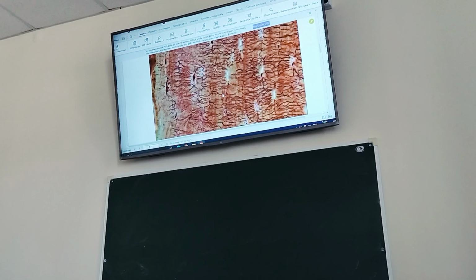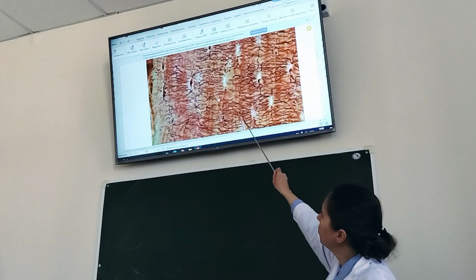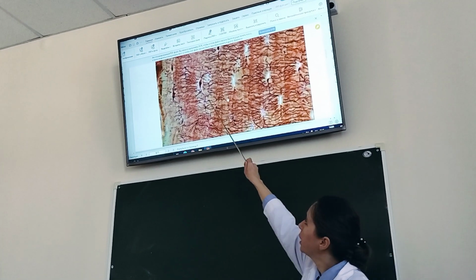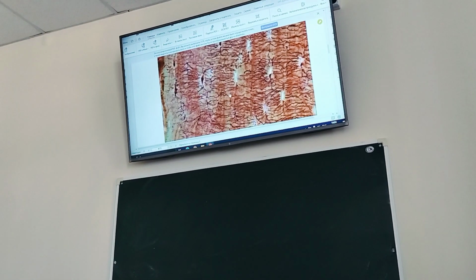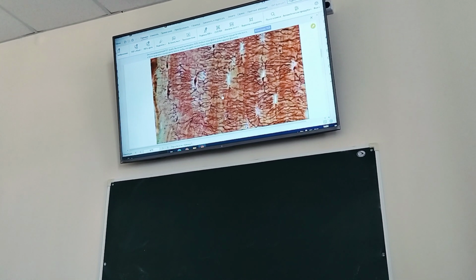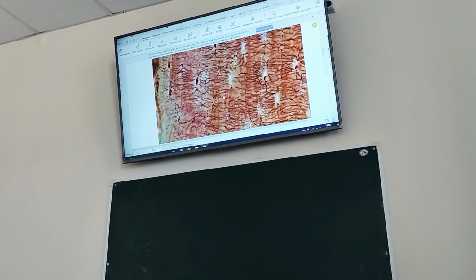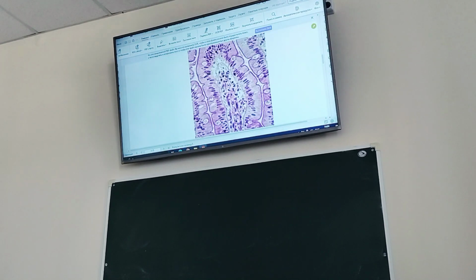What is this? Once again, what can I see? Many canaliculi and lacunae. Yes, bone, where osteocytes may be present. This is secondary lamellar bone, but in high magnification I can't see osteons here. This is just a single osteon. But I can see osteocytes, elongated almond-shaped cells occupying lacunae with canaliculi.